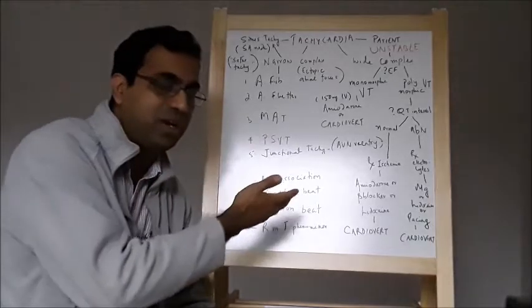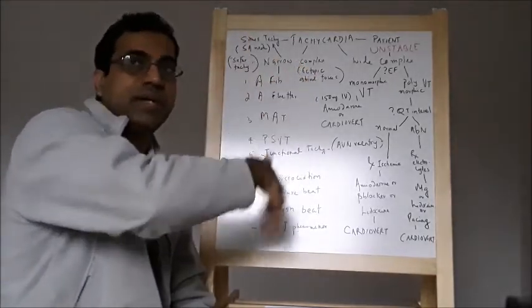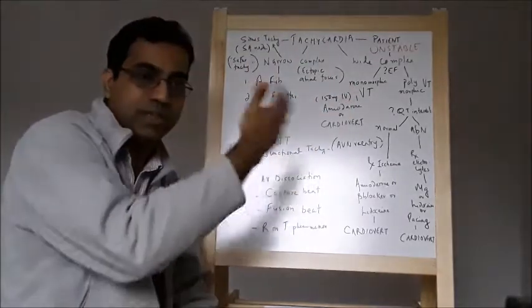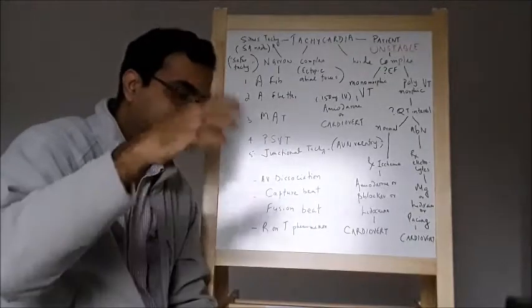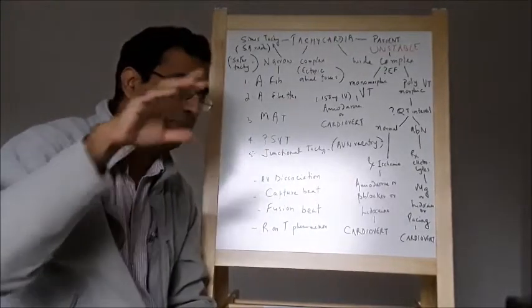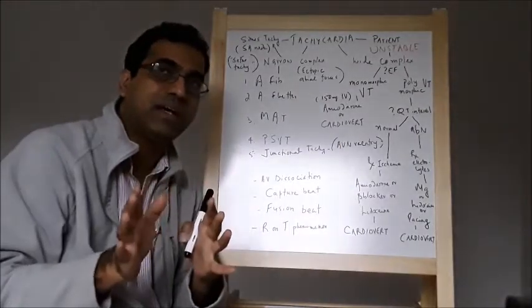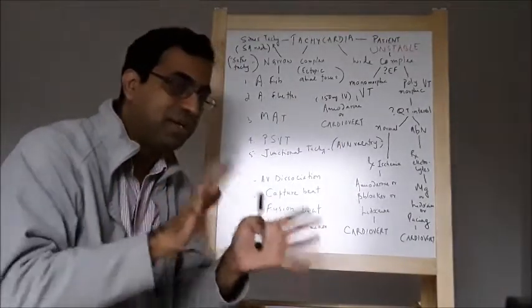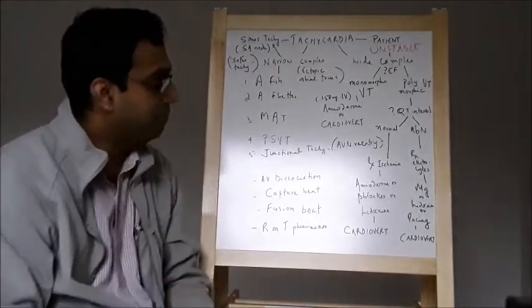I don't have EKG strips here, but you can look up monomorphic ventricular tachycardia, polymorphic ventricular tachycardia, and torsades. That's torsades de pointes, meaning twisting around the points. That's the EKG pattern, and that helps you differentiate. And any wide complex tachycardia, given the stability or the instability of the patient, usually is better to refer to as a ventricular tachycardia.